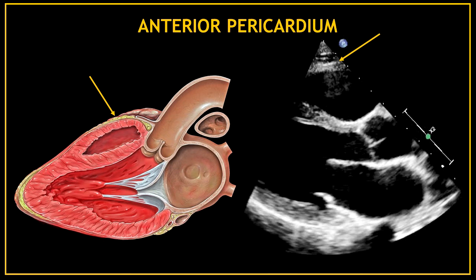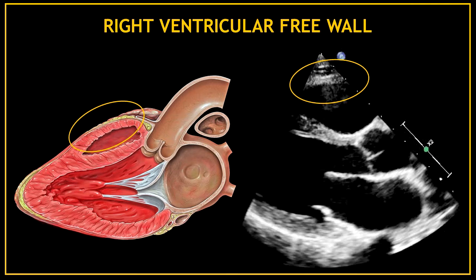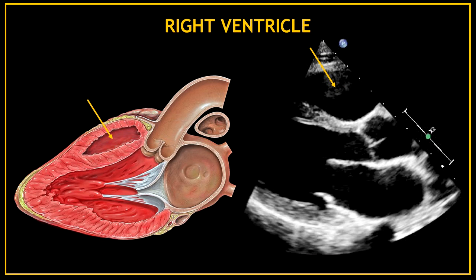The first very anterior thin line we can see there is the anterior pericardium. Under the pericardium we can find the right ventricular free wall. That first black area at the top corresponds to a chamber — that chamber is the right ventricle.